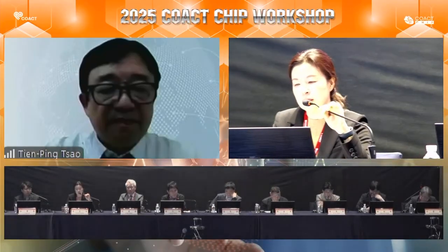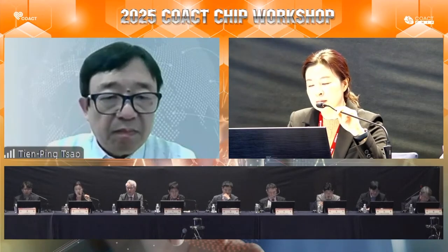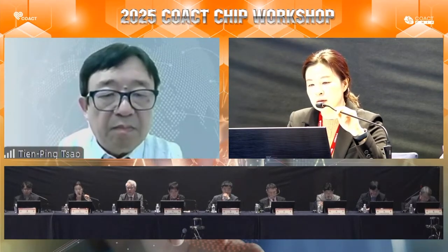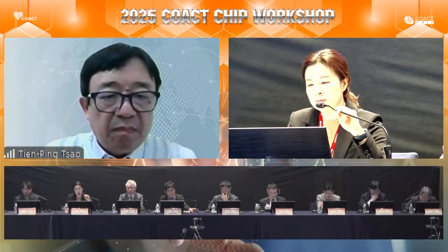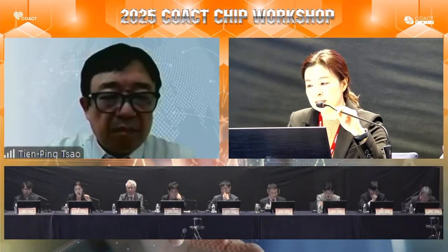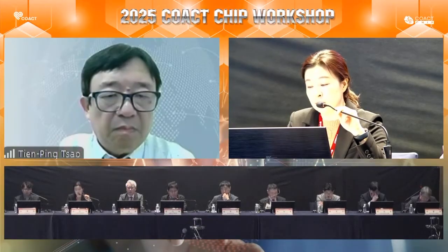Thank you for your nice lecture. Actually, I have no experience with the lithotripsy balloon, so I don't have much knowledge. But the lithotripsy balloon may not easily pass a tight lesion, so there is some role for predilation. If I perform predilation, I worry about some dissection. If some dissection happens, can I safely use this kind of lithotripsy balloon?